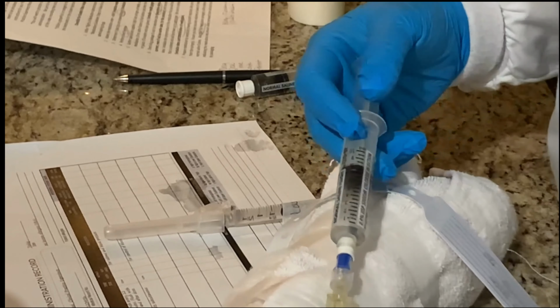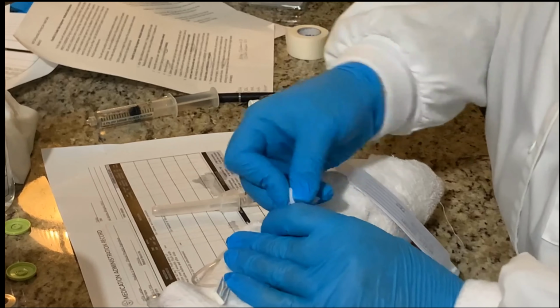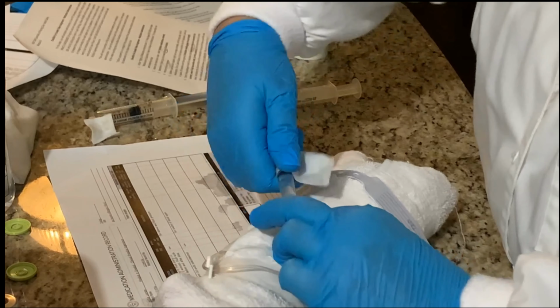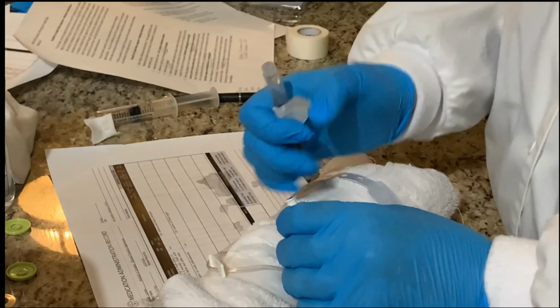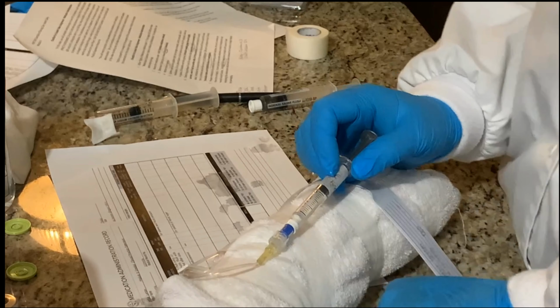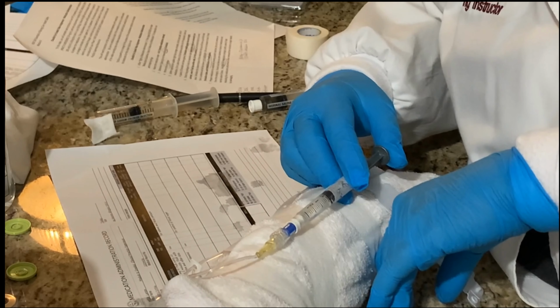So now I'm going to remove my syringe, get a new alcohol swab, scrub this again for 5 to 15 seconds. You want to scrub each time in between. Now I'm ready to give my medication. So I'm going to remove the needle and place that in my sharps container. Attach my medications. And now I have a second hand on my watch. And I'm going to give this over 2 minutes.